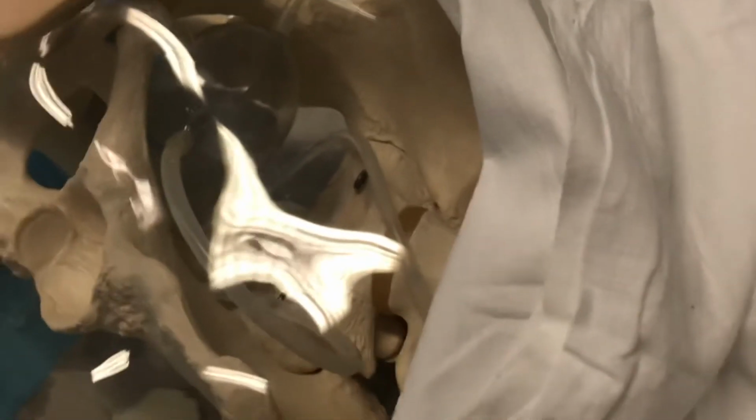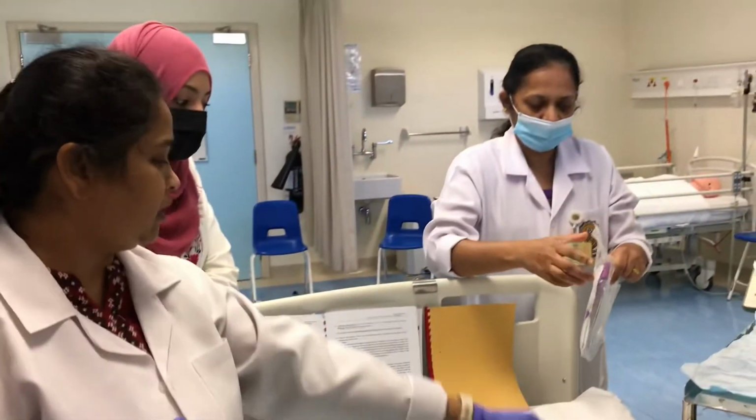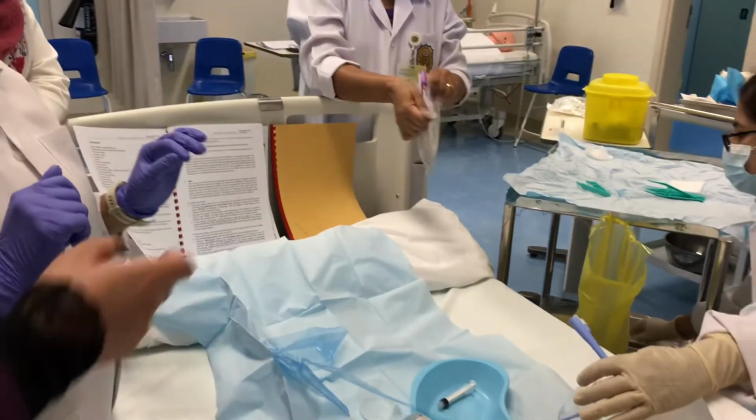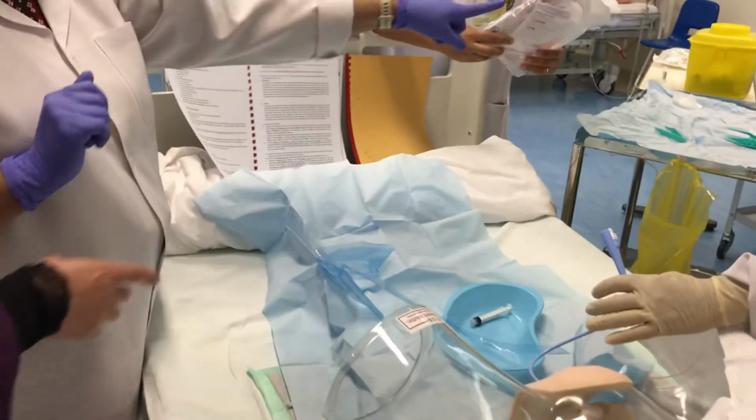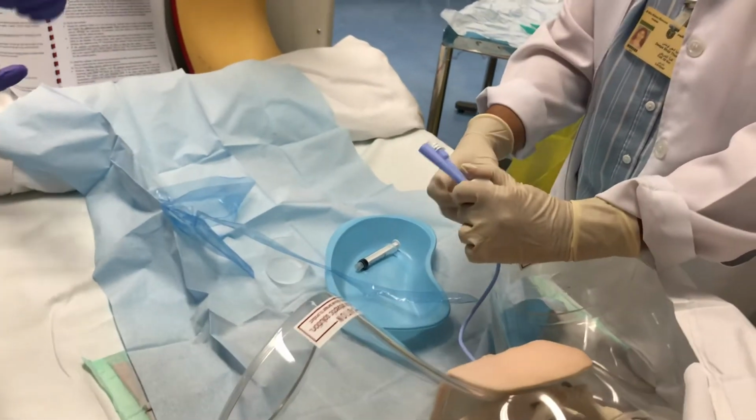We have taught them how to collect urine specimen from the catheter, right? So when urine is dripping now, she can use the same container to collect urine, or the container directly here. She can use it to collect for the test.